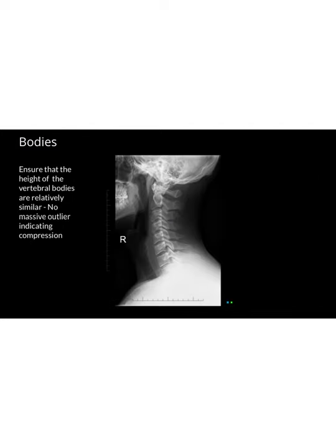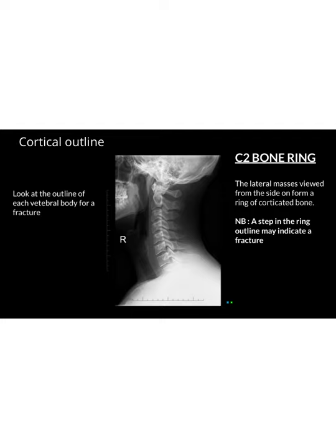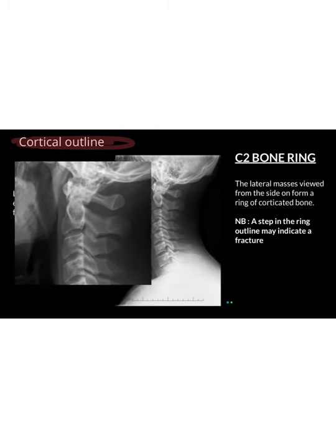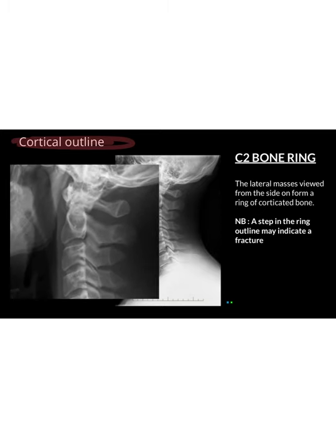In B, which is our bodies, we're looking for any deformities of the body and ensuring that each body is relatively the same height. Then C, our cortical outline — we look at the outline of each vertebra to determine if there are any fractures. Importantly, we also look at our C2 bone ring, which is made of the lateral masses viewed from the side, forming a cortical ring of bone. Any step in this ring may indicate a fracture.